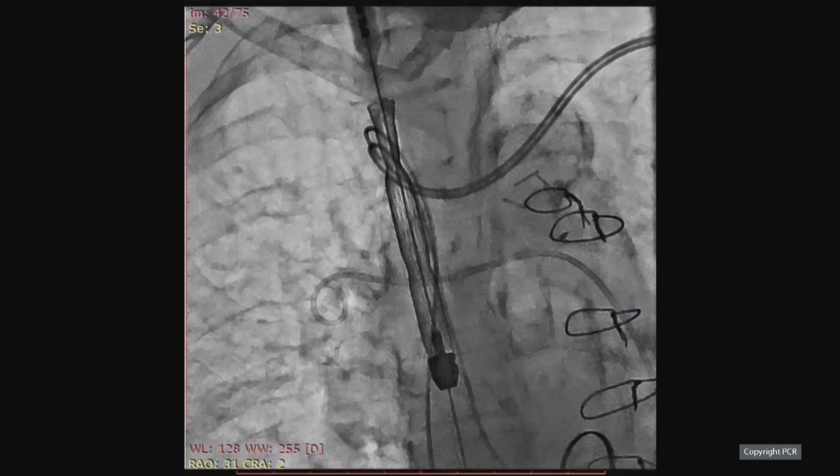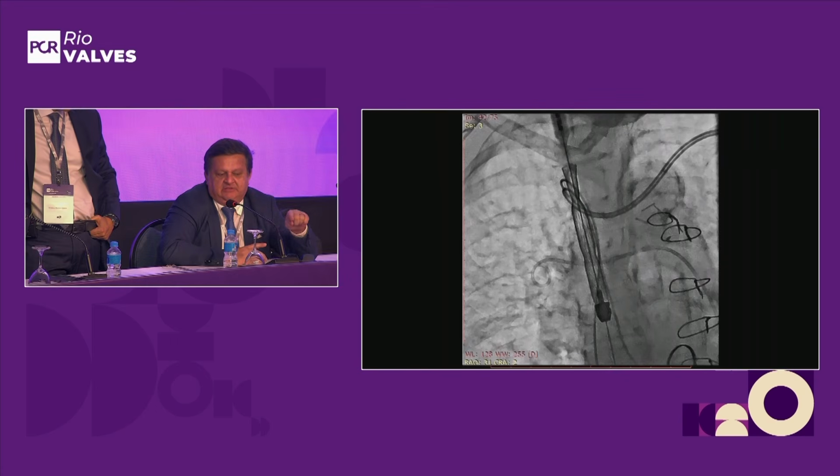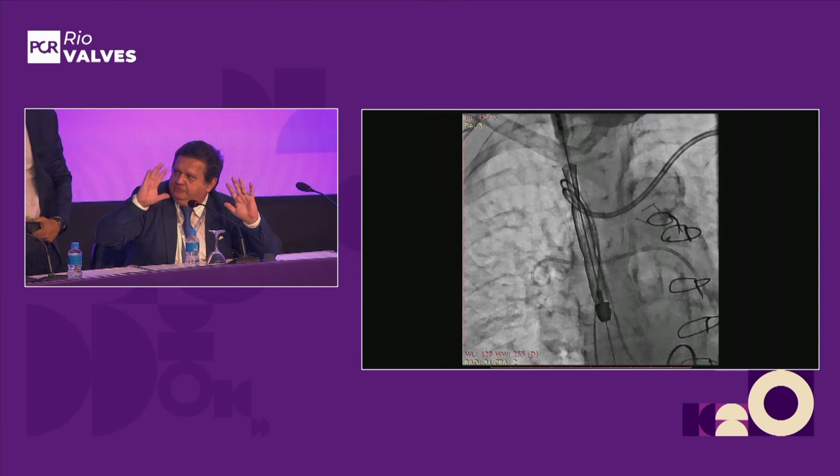Yeah, I think that you will not do a shot of contrast. Zero, zero, zero, zero. Nice. So just the catheter. Yes, the only concern here, if it's your pigtail, is the right place, not in the inferior branch, you know, because sometimes you can have some confusion in your position.